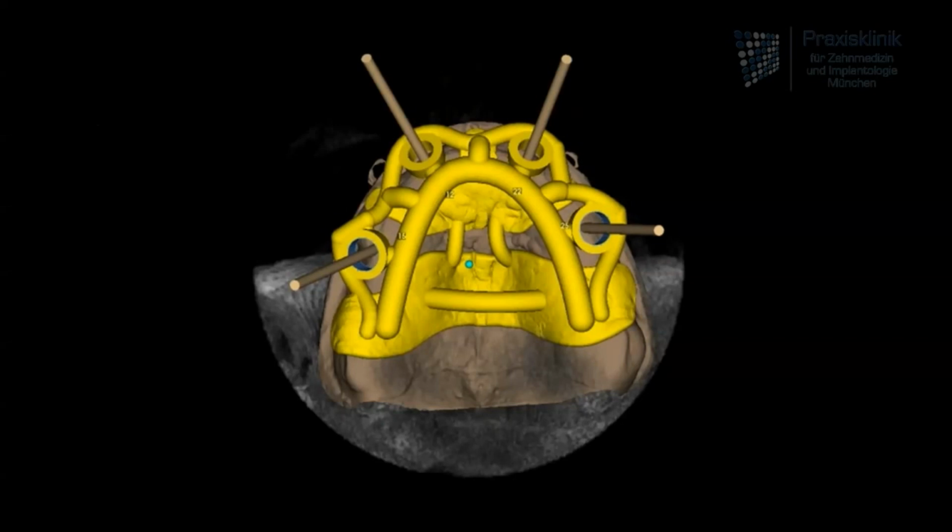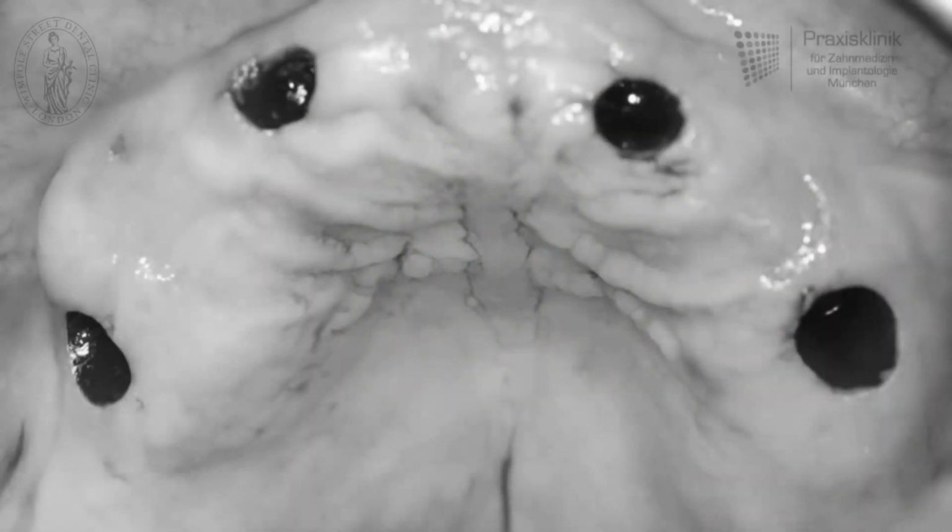This kind of template enables us to transfer our virtually planned implant position into reality. So this template will guide our implant drill right to the defined position of the implants. In favorable terms, meaning in this situation that we have enough bone at the planned implant site, we can place implants without cutting the soft tissue, having only a small punch in the area where we want to place our implant.